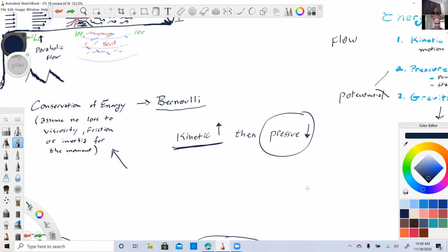Well, that's a little bit overdone, but that rounded peak, that long acceleration time, that of course is our tardus parvus. Tardus parvus is a reaction of the loss of energy.